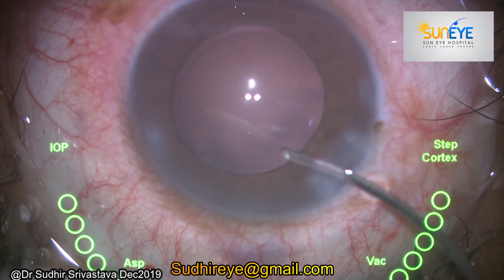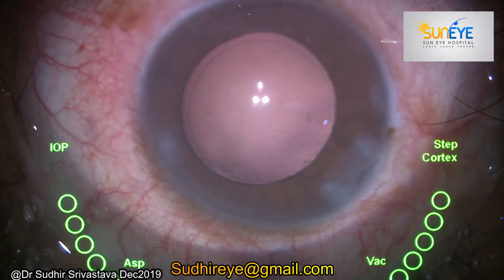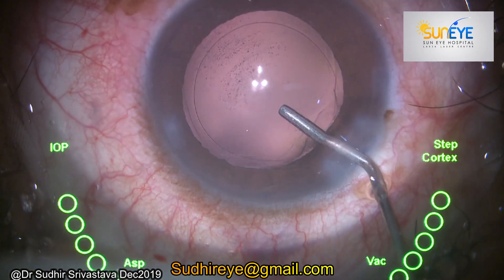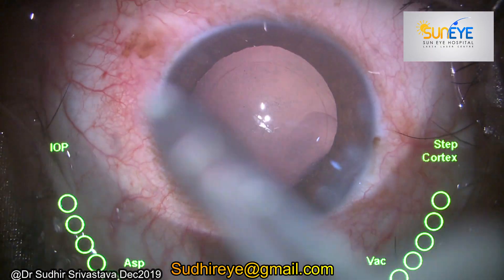I always do my maneuvers quite away from the cornea, just to take care not to damage the endothelium. Normally I do not touch the conjunctiva because I don't want any subconjunctival hemorrhage in the per-operative and post-operative period.